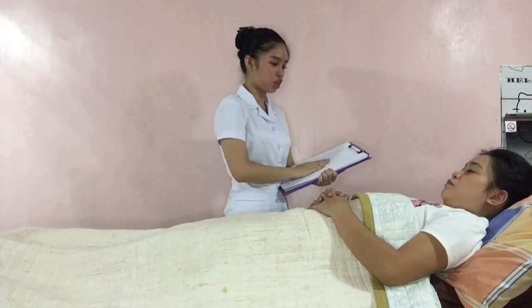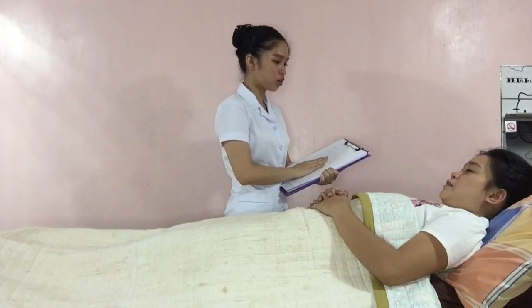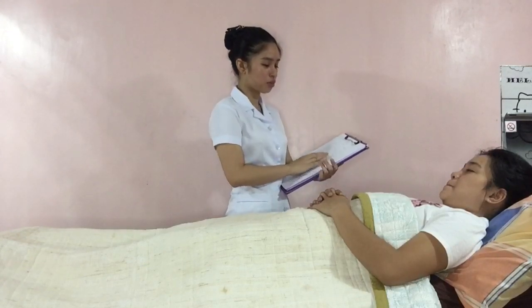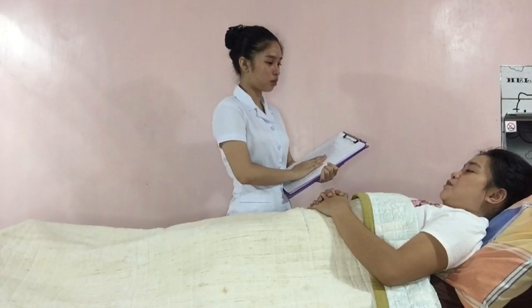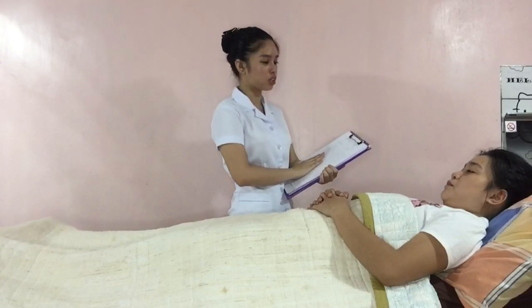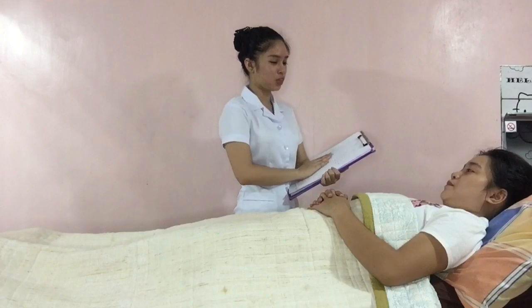So the procedure that I will be doing is that I am going to administer the medication through an intramuscular injection, because this allows the medication to absorb quickly into your bloodstream. Is that okay with you? Do you have any clarifications or concerns, or do you want to relax before we proceed to the administration? As you can see, I closed the curtain so that no other people can see us, and the information that I will be getting from you is secured and safely handed to the doctors. So let's start with the assessment.